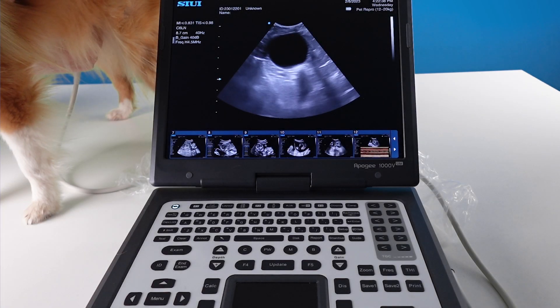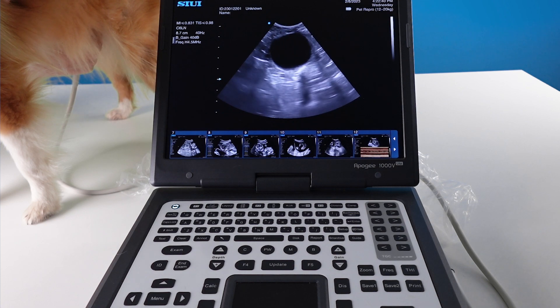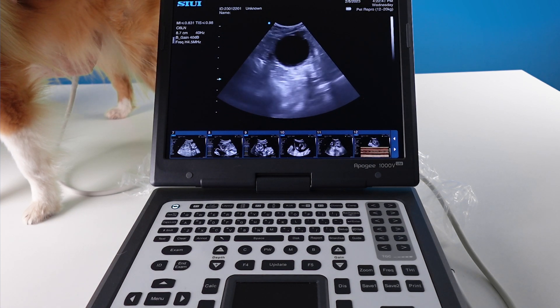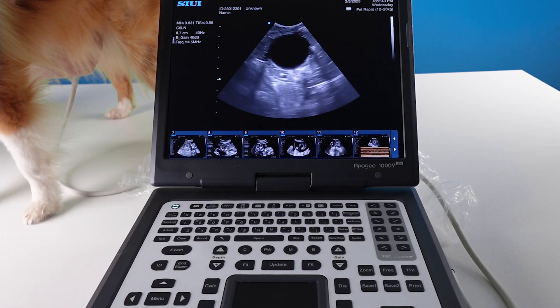Hello and welcome to this video. Today we are going to show you how to estimate gestational age by measuring head diameter and the gestational sac on the Sui Apogee 1000 light. For this demonstration we are using Doppler who isn't pregnant, so instead we are going to be using her bladder, but the principles are the same.